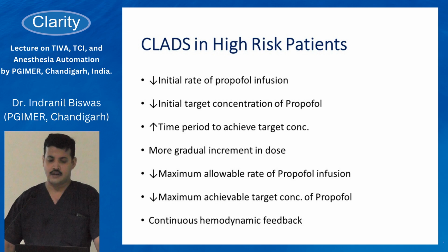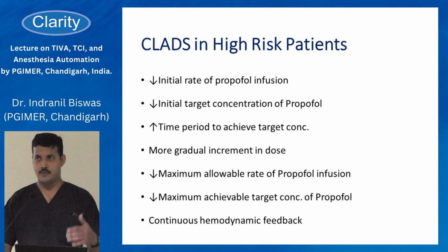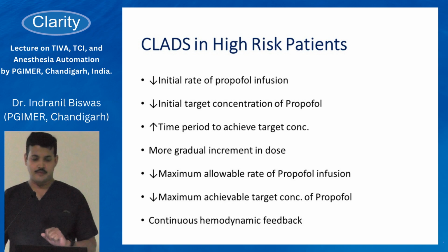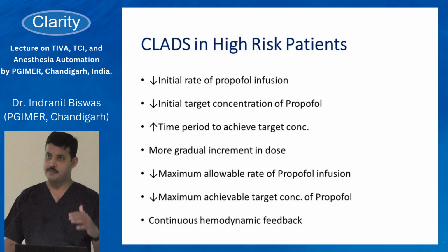Also, the initial target concentration of propofol is reduced, the time period to achieve the target concentration is increased by default, and the increments in dose required for achieving and maintaining the target are more gradual than in a patient deemed low risk by the system. At the same time, the maximum allowable rate of propofol infusion and the maximum achievable target concentration of propofol are also reduced, keeping in mind the altered pharmacokinetics and pharmacodynamics of propofol, which I already told in the previous slide.